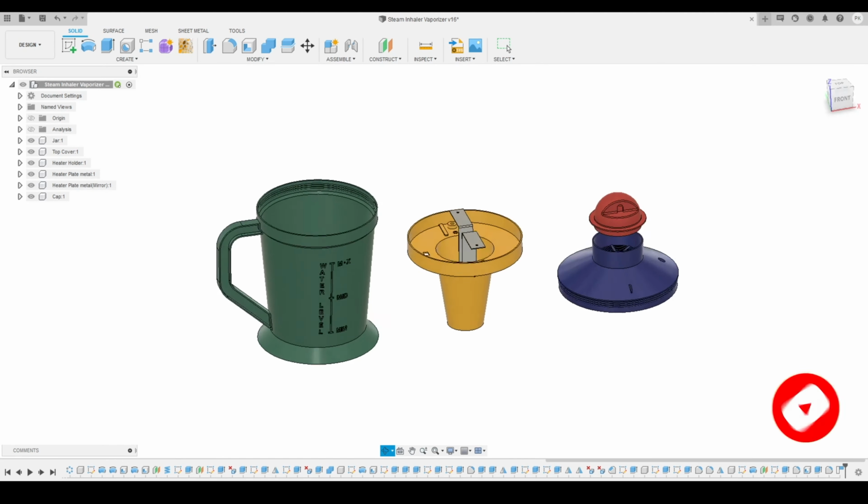So I will just go to the create panel again and we'll click on create a sketch and we'll select this front plane as a sketch plane. So I will select this plane. Here you can see, the moment I clicked, all the sketch tools are active. So we'll activate our line tool first and we'll start with tracing the outer details of this jar. Here you can see I'm just tracing using my line tool.